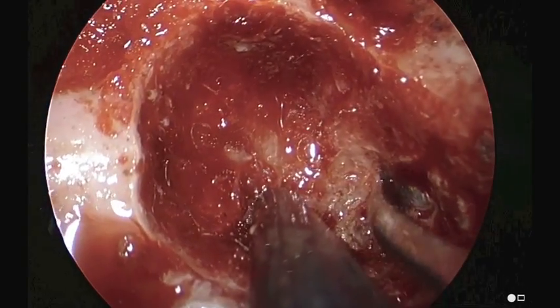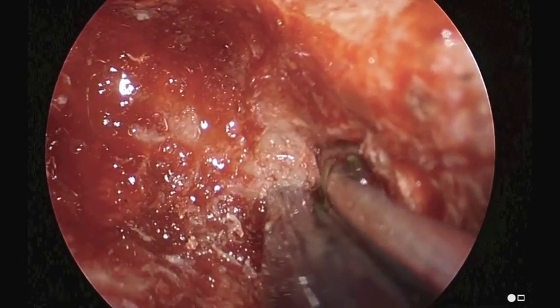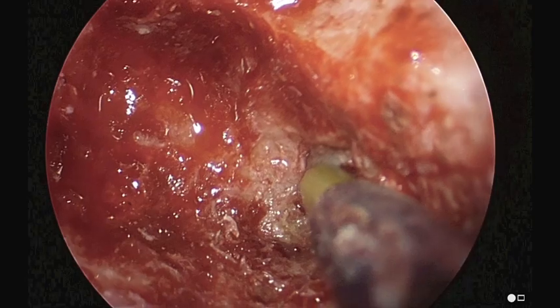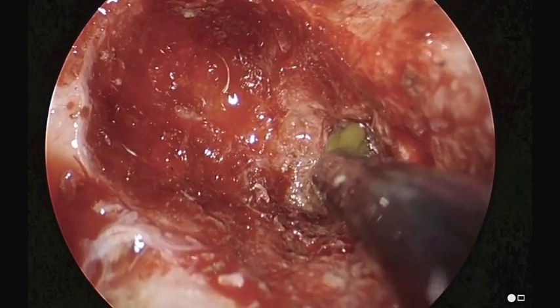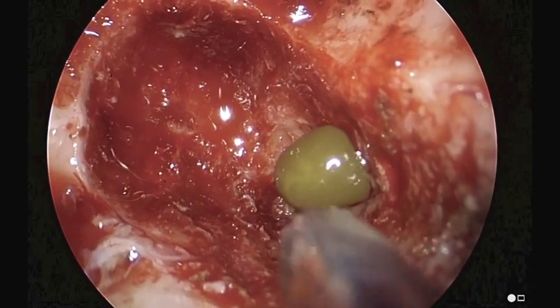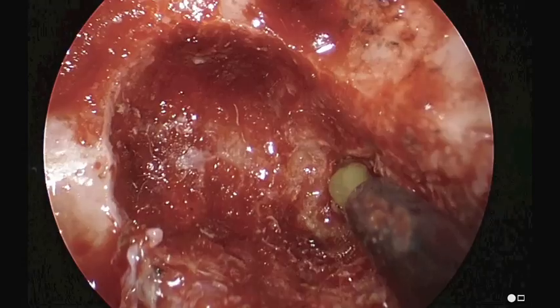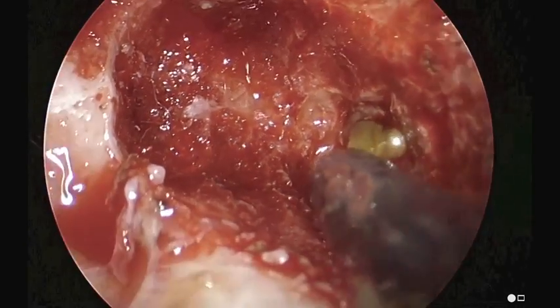We're now going to puncture it and release the granuloma fluid, which is under tension. It's green and viscous. This is suctioned out, and eventually we're going to irrigate this cyst cavity. We're going to try to maintain its opening by cutting back the cyst wall cavity to the area of the bony opening.